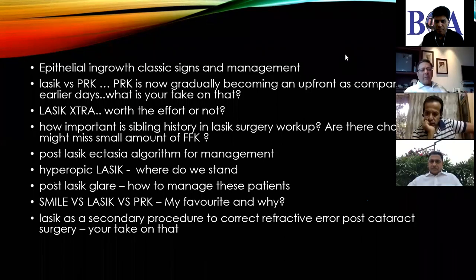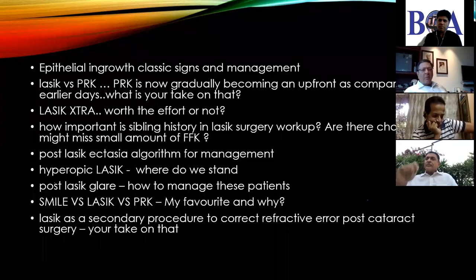You would lift the flap? Yeah, I would treat an epithelial ingrowth if it's affecting vision, or if it's coming close to the dilated, the mesopic pupil size, because that will affect the vision. Flap melts we are not going to see anymore. But it's very important in the procedure of removing epithelial cells to remove them both from the bed as well as from the flap.